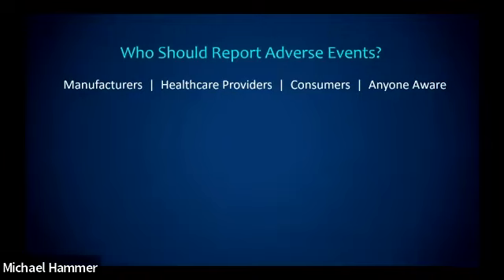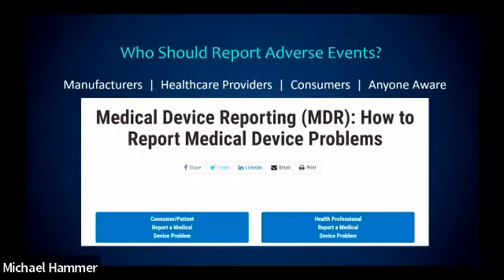We're not reporting events to say we're going to put you out of business. That is not the goal. We are reporting events to learn from those events so that we can prevent adversity from occurring in the future. So manufacturers, healthcare providers, consumers, anyone that's aware. And again, FDA, because they regulate this industry, they carry the responsibility for managing adverse events in the United States.